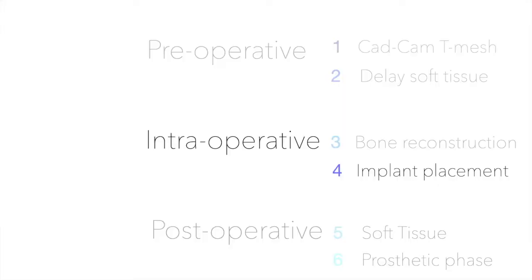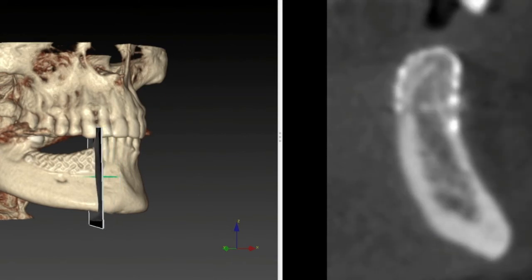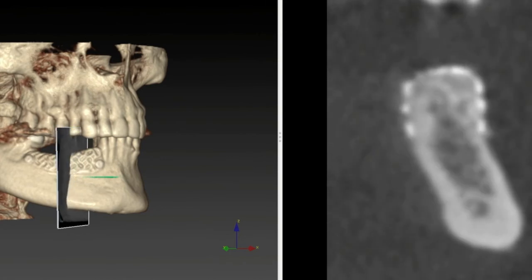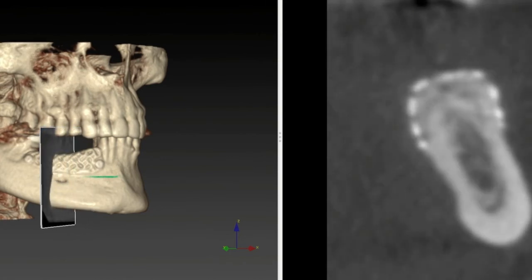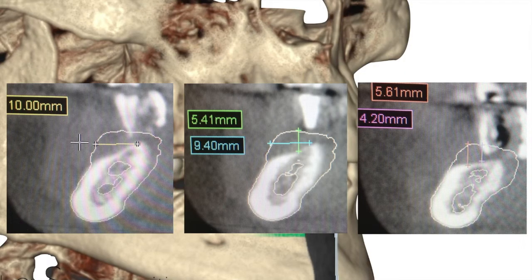There were no complications in this patient — no membrane exposure. A new CBCT shows beautiful integration of the graft with the recipient site. Using a superimposition technique between the pre-operative CBCT and the pre-implant CBCT, we can appreciate a 1 cm horizontal gain and 5.67 mm vertical height gain.